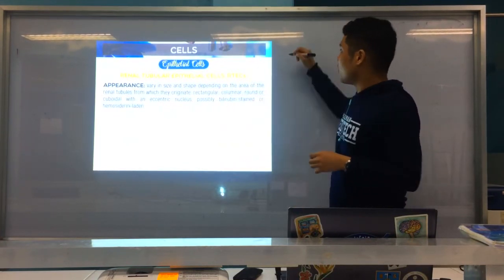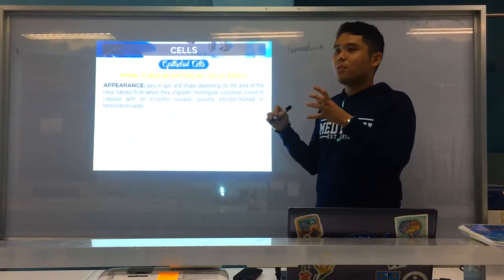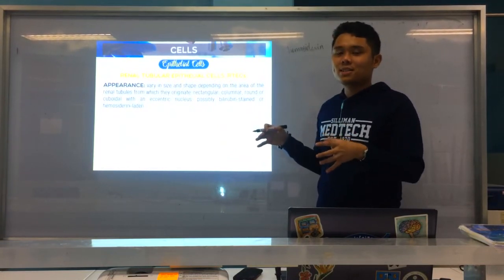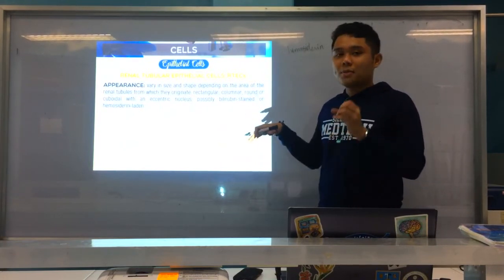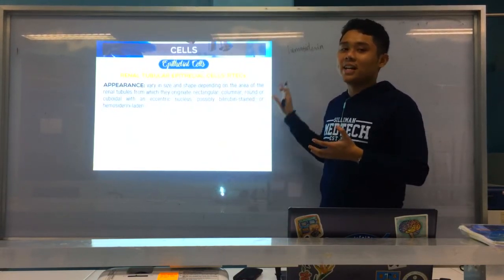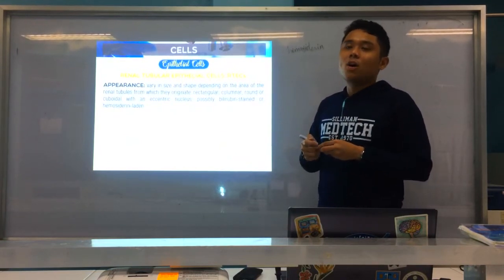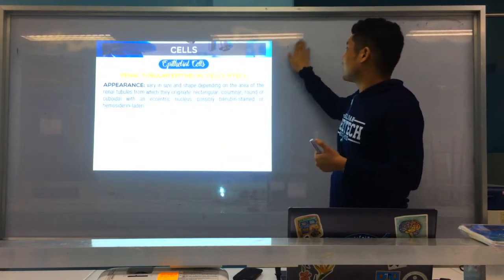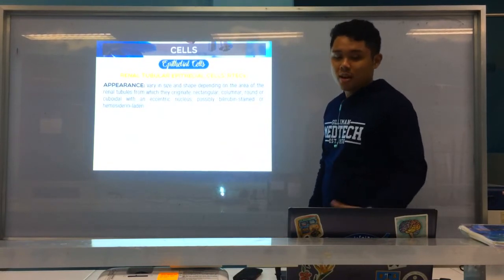Now, hemosiderin, when you say hemosiderin, guys, this is just parang a further breakdown of hemoglobin, di ba? In terms of mga massive hemolysis, so daghang hemoglobin sa imuhang kidneys. So what happens is pwedeng ma-absorb sa imong RTEs ang hemoglobin, and then further breakdown, may muna siyang hemosiderin, and then pag stain ana niya using a Prussian blue stain, or another type of stain, munang makitaan ang hemosiderin granules. So, that's the RTEs. Again, it's the most significant because gikan na siya sa tubules mismo.